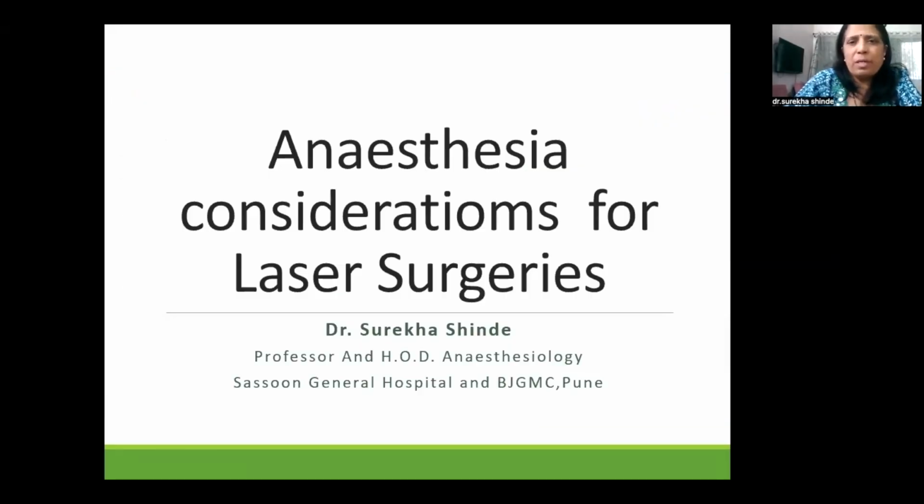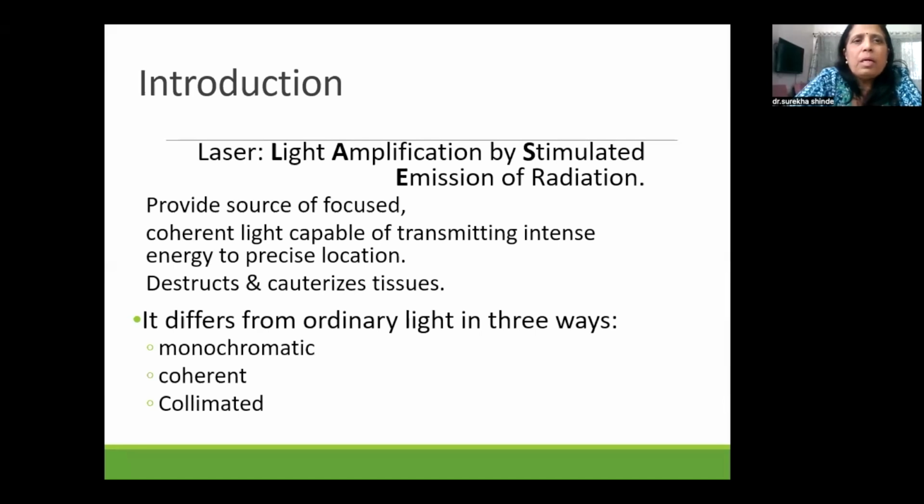Anesthesia considerations for laser surgery. Let me introduce you. Laser, you know, everything about light amplification by stimulated emission of radiation. What does laser do? It provides a source of focused, coherent light capable of transmitting intense energy to a precise location. And what we desire is destruction and cauterizing of tissue.